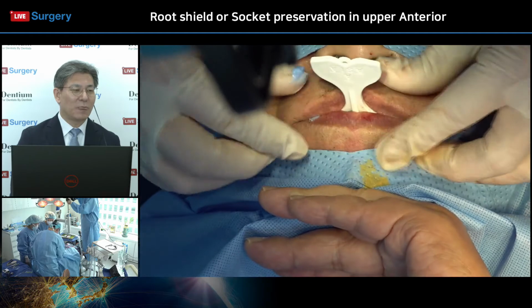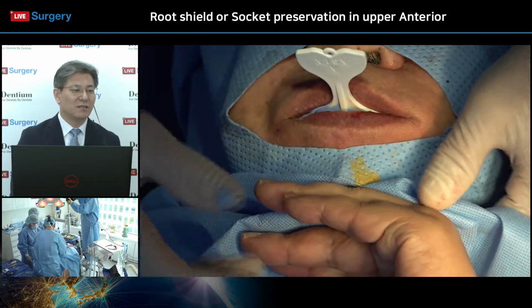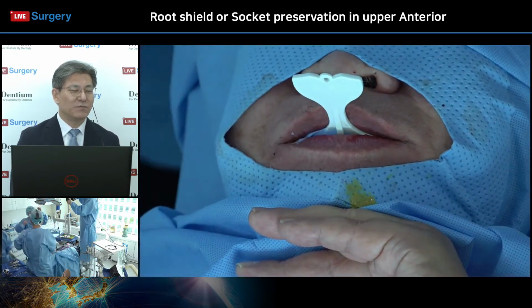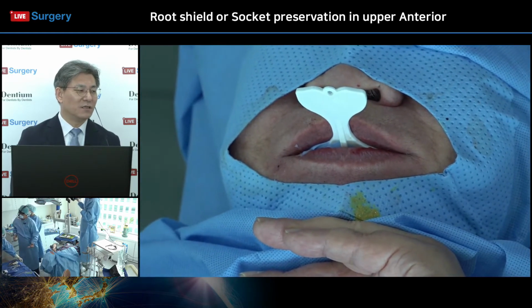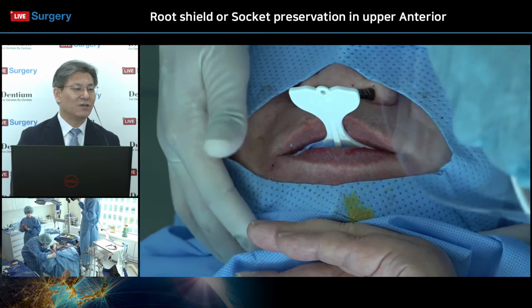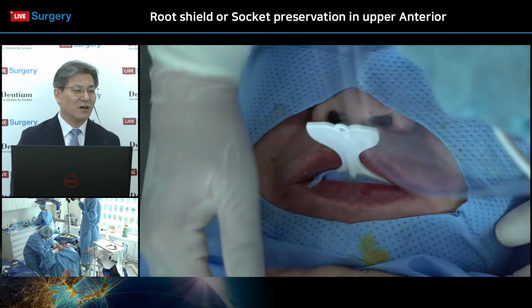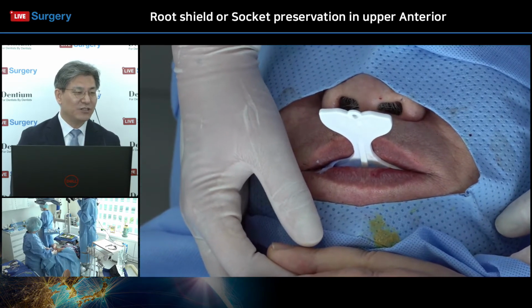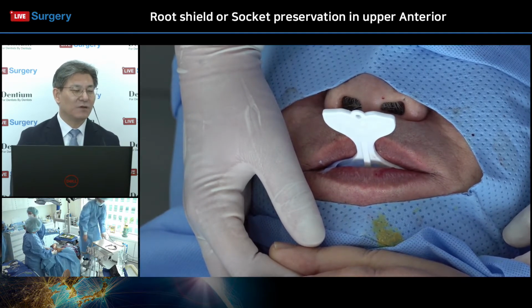Bite firm. The patient should bite firm for 5 minutes for setting the lower impression material. Okay, so this one is a new technique. The intraoral scanning is popular now, but this bite tray registration technique is very simple, even though it is the conventional type, right?